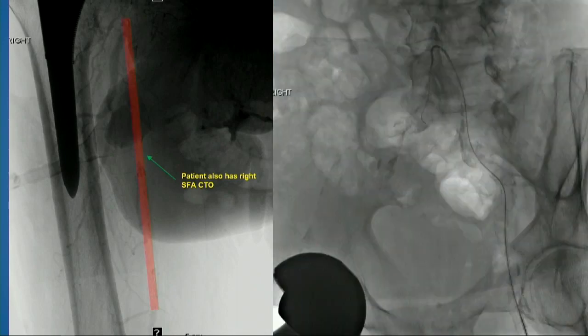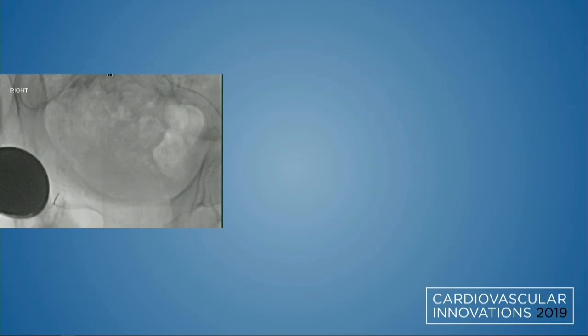So on this patient, I have access on both sides, usually for a complete iliac occlusion. It's always good to have a target, so this is the path you kind of want to take. Sometimes with access, contrary to most things in life, I think keeping it small is better here. Usually just a micropuncture needle, an 018 wire, and the inner of the micropuncture is sometimes all I have to get across. And it does work in many situations.